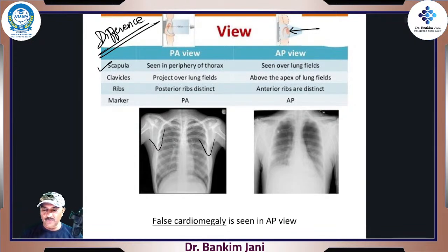In the AP view, the patient is lying, so those scapulas will be overlapping. They will be overlapping the lung fields. This is very important. Very important. This is one.